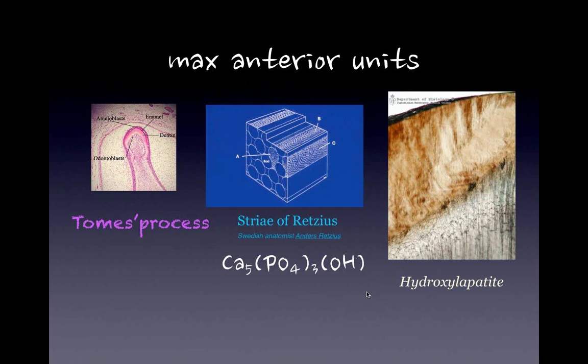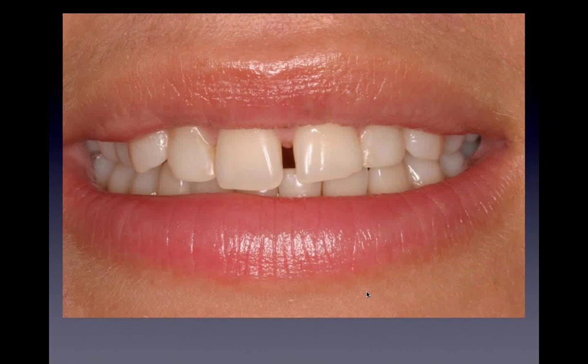So when I'm looking at the preparation design, especially when we're doing around the tooth, we're trying to close the space. This patient wants to close the space. So this is a case where, if I'm doing the 4 teeth, I've got to get it perfectly right. We can't do this freehand.